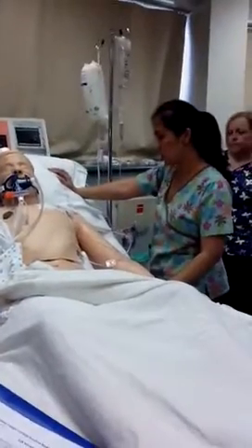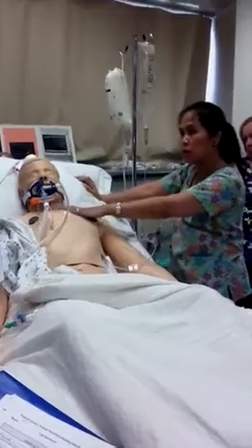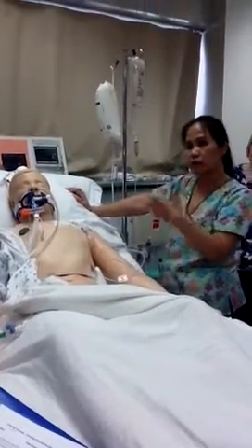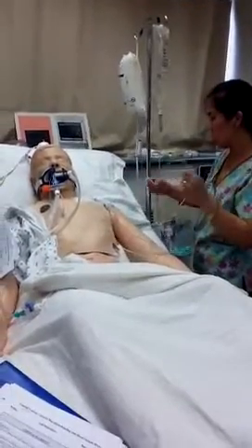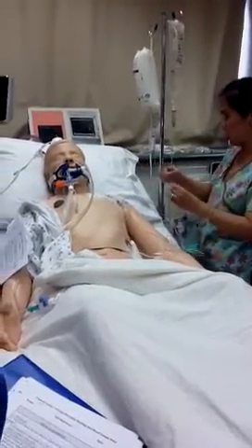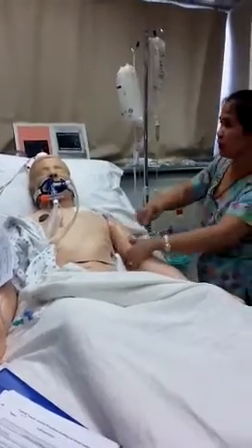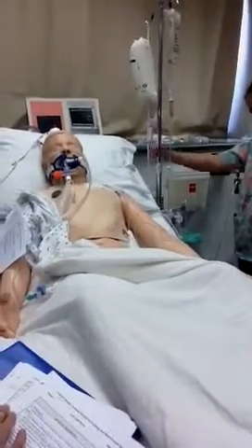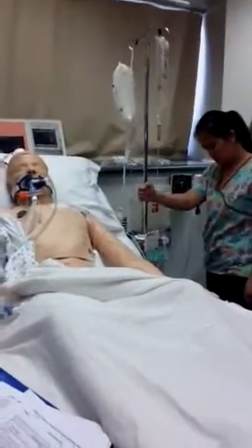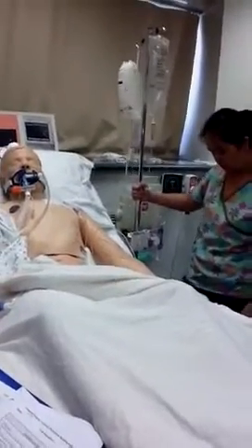What else for the central line? If you do need to change the dressing, it's sterile technique. Make sure you wear your mask, and then after the procedure, you document your procedure. Hopefully now that they are going to be computerized, there's probably in their documentation system that I zeroed and leveled. There's a kit put together for this. It has the bio patch and everything. You just get that, get your mask and gloves.